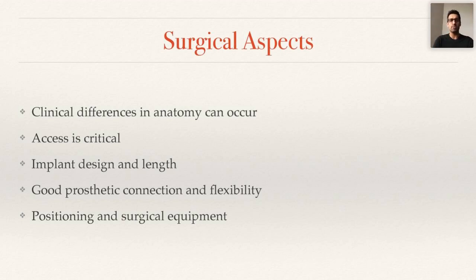Access is critical. So when I assess my patients for full arch treatment, I will always document mouth opening, and ideally you want at least 45 millimeters, but ideally 50 millimeters of mouth opening because access is crucial. You need the access to visualize and for the drills and for the implant placement, so it's important.